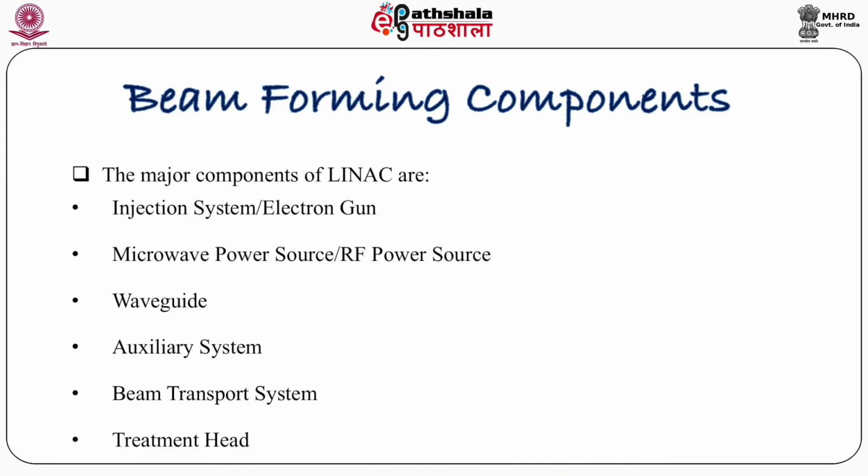The major components of LINAC are the injection system, electron gun, microwave power source or RF power source, waveguide, auxiliary system, beam transport system, and treatment head.